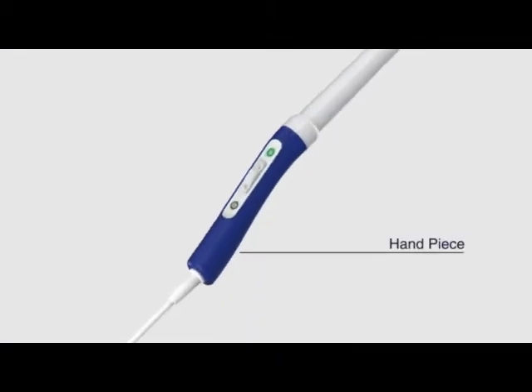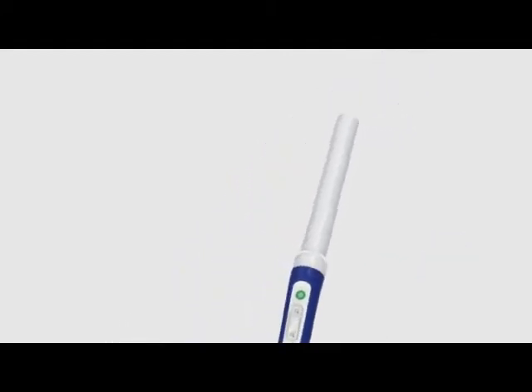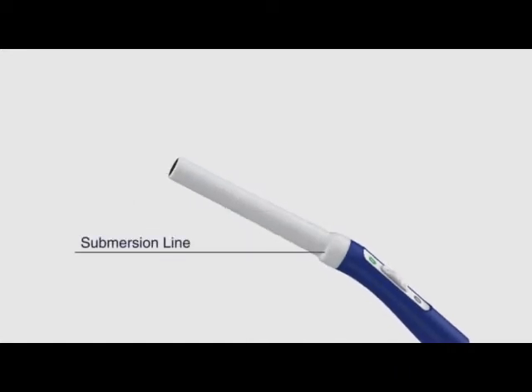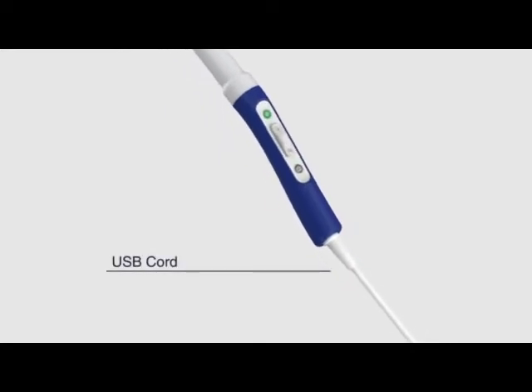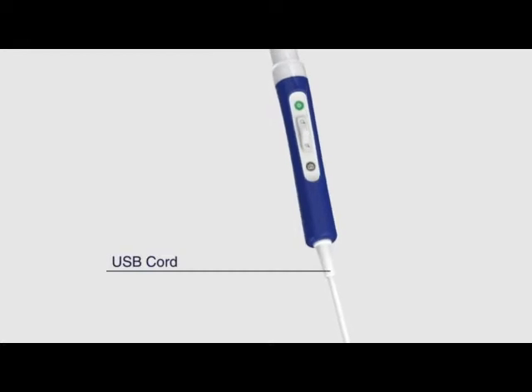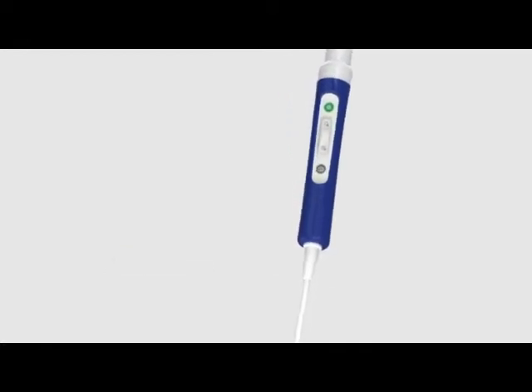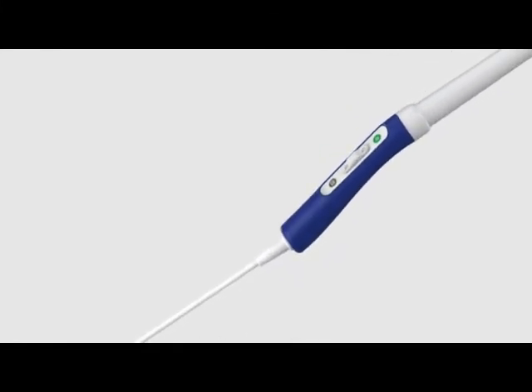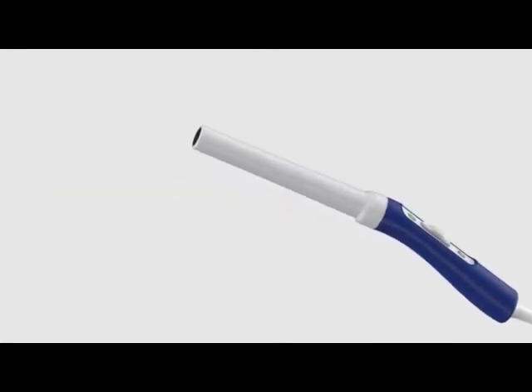The pocket colposcope has a blue handpiece which the provider grips and a white part which inserts into the vagina called the probe. The submersion line is the border between these two parts. The wire at the end is a USB cord which can connect to a computer, or with the proper adapter, to a tablet or phone. The connected device serves as the power source for the pocket colposcope and can run a Windows, OS X, or Linux operating system. At the opposite end is the camera, which takes photos of the patient's cervix.